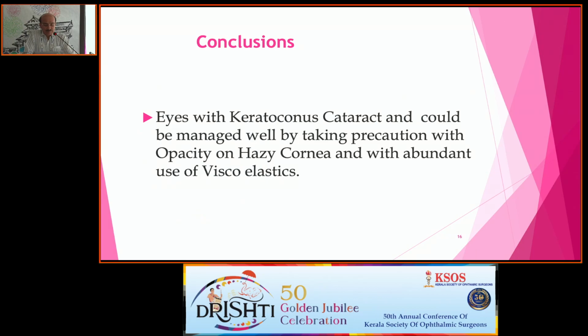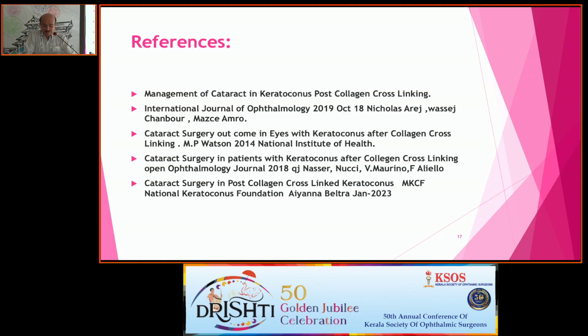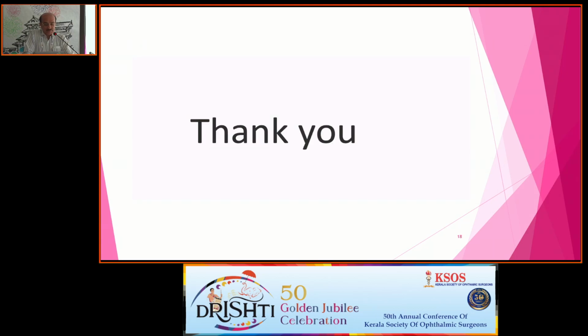To conclude, eyes with keratoconus and cataract could be managed well by taking precautions in case of opacity or hazy cornea, with the abundant use of viscoelastics and keeping lower phaco parameters. These are my references. Thank you.